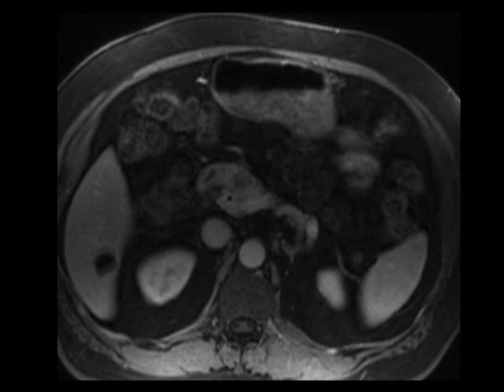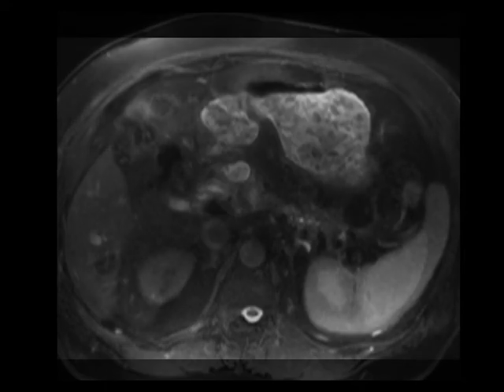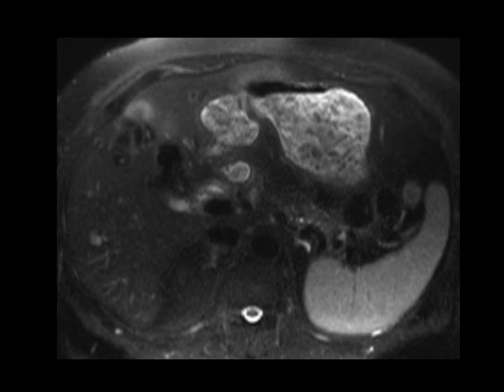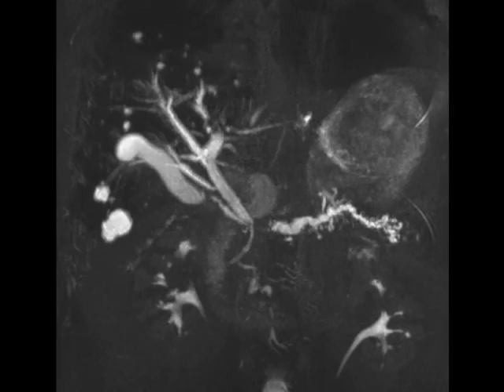As you can see on these images, there is a relatively low-intensity, poorly enhancing mass identified within the pancreatic head — not that easy to identify just on the post-gadolinium images. But on the MRCP images, this patient clearly has a double duct sign with dilation of both the CBD and the pancreatic duct to the level of the pancreatic head. And most usefully, on the ADC map, this mass demonstrates significant restricted diffusion.